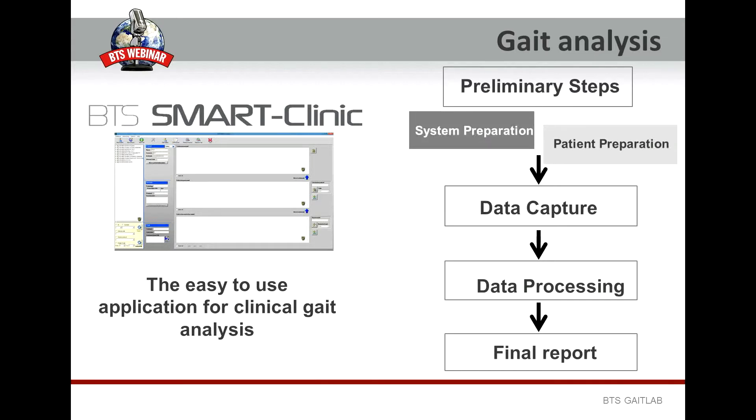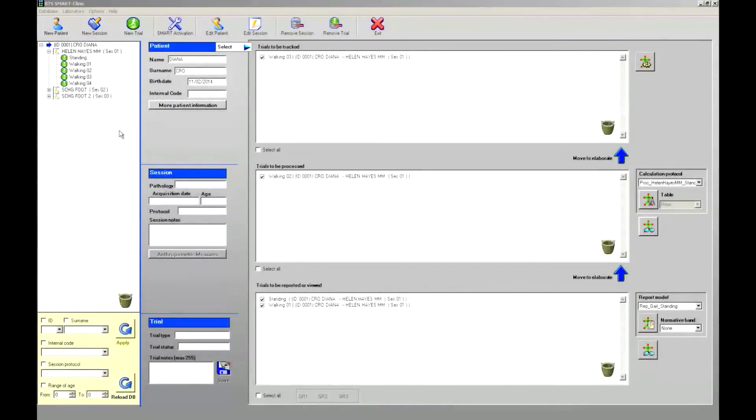We are going to focus our attention on the preliminary steps required before starting with the data capture. This is the SmartClinic application. As soon as we run SmartClinic, the clinic database containing all the patient data will open. On the upper part of the screen there is the main menu, from where we can manage, for example, the database and open other different menus and options.